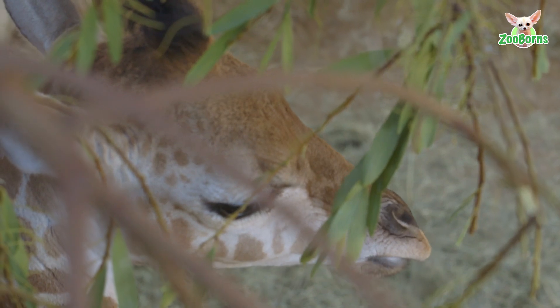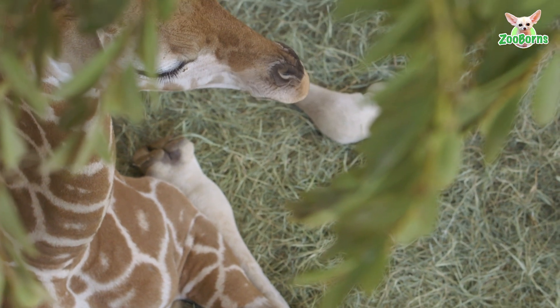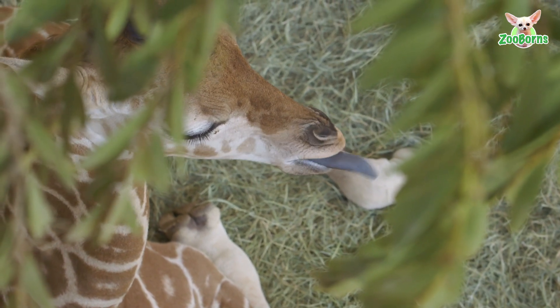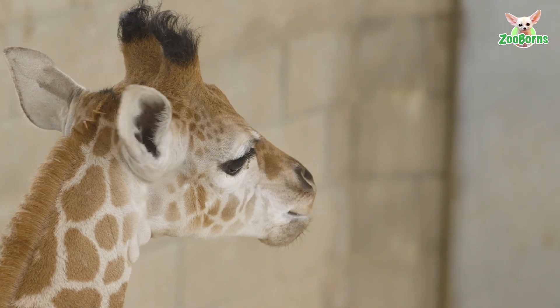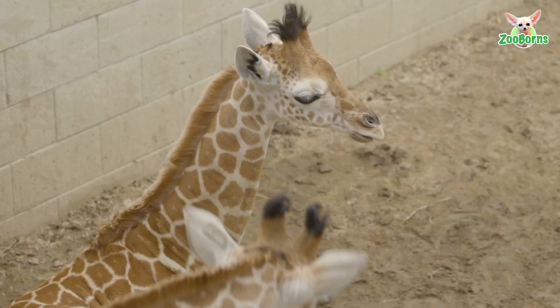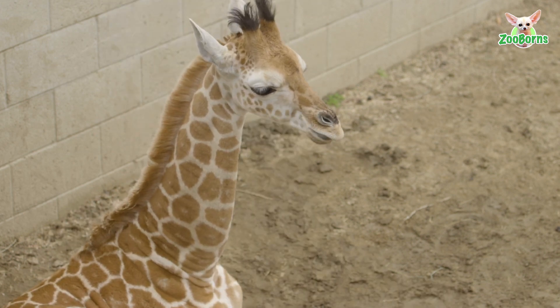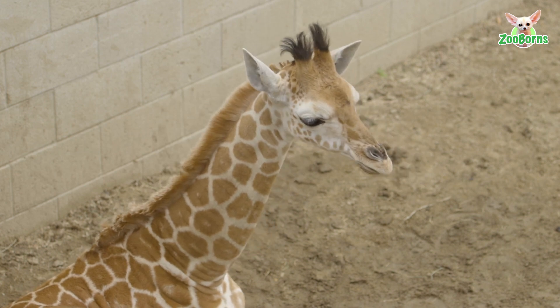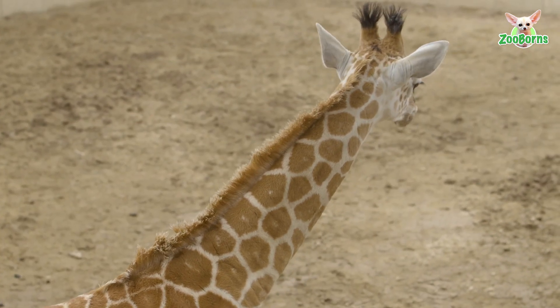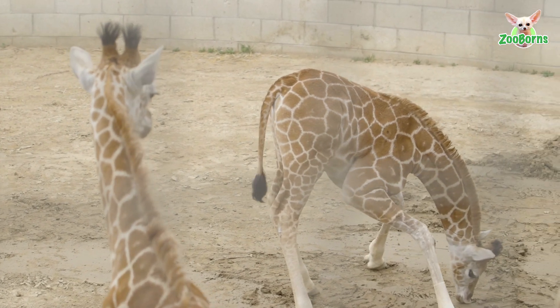Most of our patients at San Diego Zoo Wildlife Alliance are anesthetized. These are animals and we have to make sure everyone is safe. This giraffe is 70 kilos — close to 150 pounds — and if she wanted to kick or buck she could cause injury to humans. So to work safely we make sure she's anesthetized at a plane where she's not going to move or kick, and won't feel discomfort during range of motion work. There are risks to anesthesia, but we mitigate those with endotracheal tubes, IV catheters, and a dedicated anesthesia monitoring team.